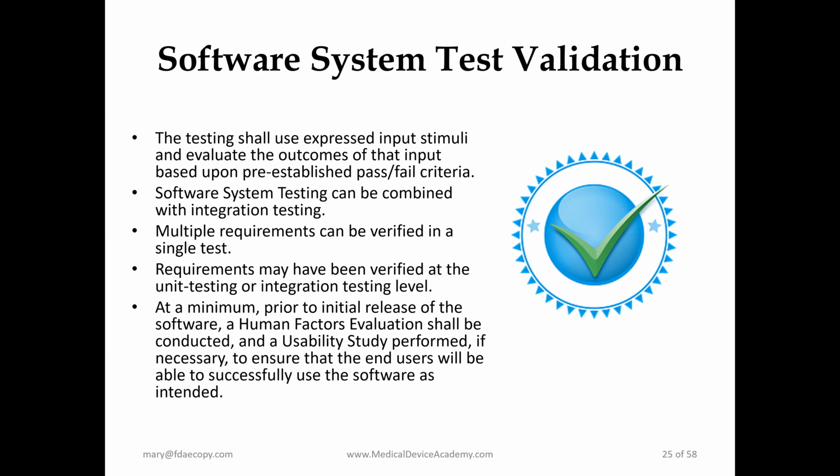You can combine multiple requirements into a single test with this. Like most validation activities, you're testing the high-level functionality and making sure the critical essential requirements of your software are being met.